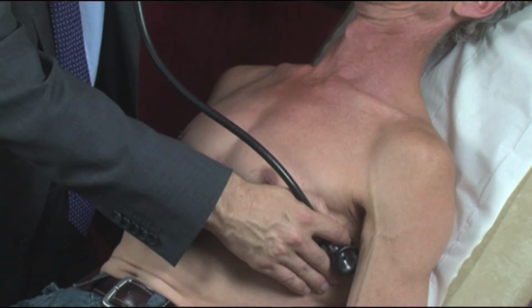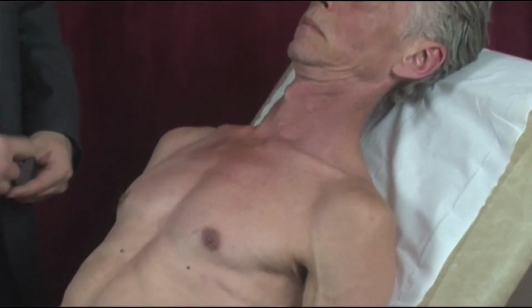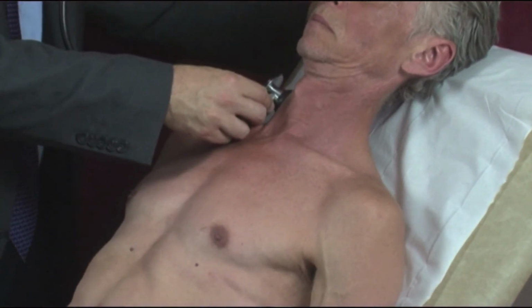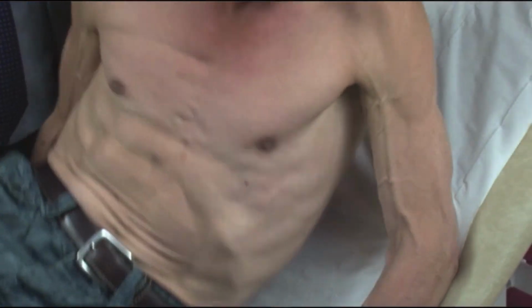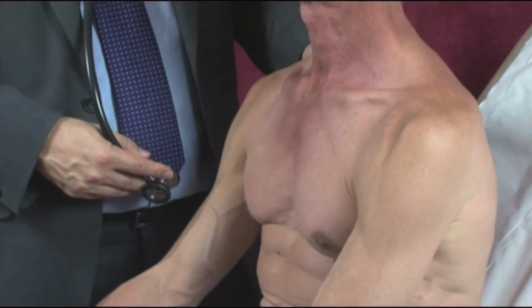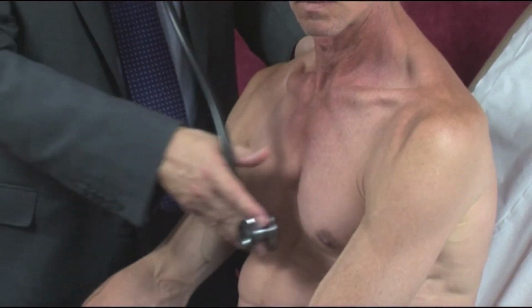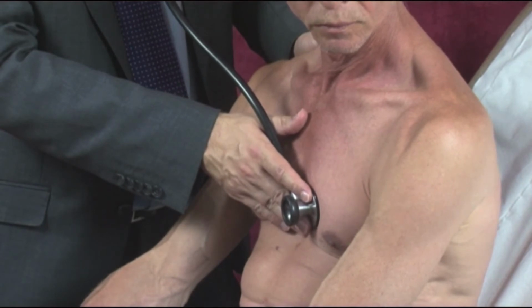As murmurs radiate, and this can help to characterize them, the clinician needs to go to listen in the axilla and then up into the carotids. Due to the difficulty of appreciating diastolic murmurs, it is then generally recommended for the patient to be rolled to the left and auscultation performed with the bell to hear for mitral stenosis. And then the patient sat forward in forced expiration in order to hear aortic incompetence, most easily heard at the left sternal edge.